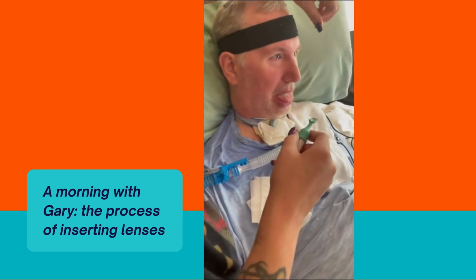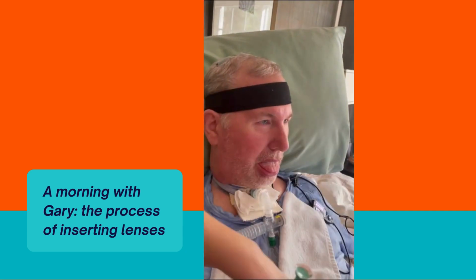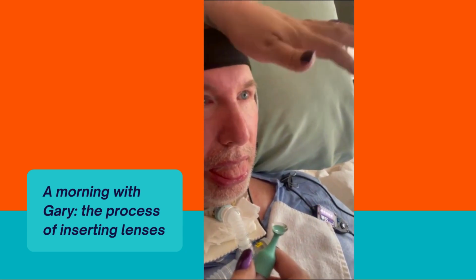So we're going to come over. She's still got him tilted up. He's still sitting very much up. Far eye. This one is going in the left eye. It's a little bit more the one you're reaching over. Yeah. So show us how you reach over.